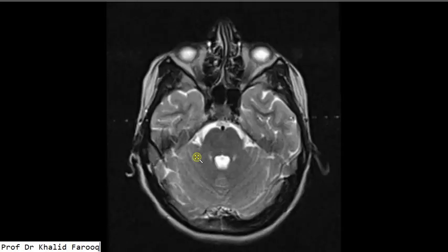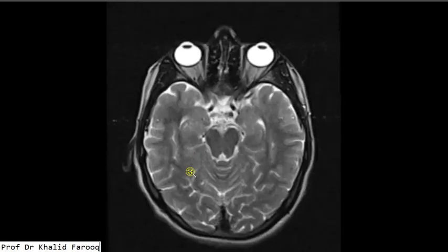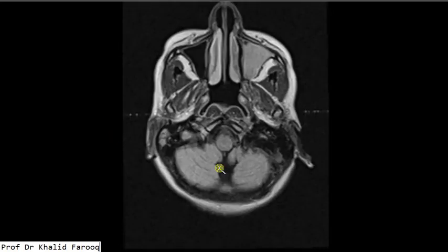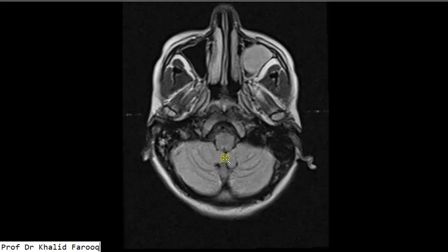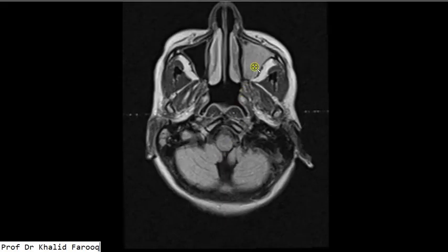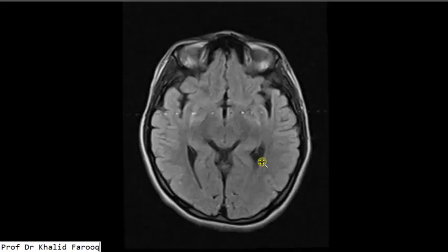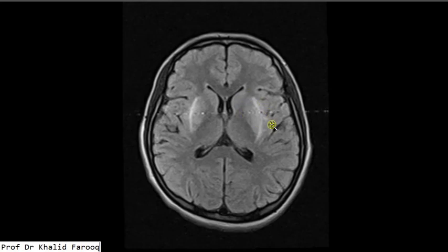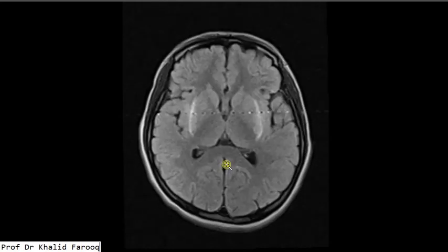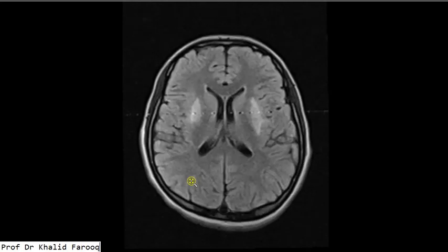So these are two symmetrical abnormal areas involving the basal ganglia on either side in the supratentorial compartment. We need to confirm it on FLAIR sequence. Here we can see the FLAIR sequence showing abnormal increased signals in a symmetrical fashion involving the basal ganglia on either side, while the ventricular chain and remaining peripheral gray and white matter appears unremarkable.